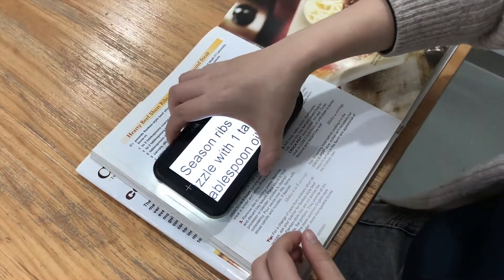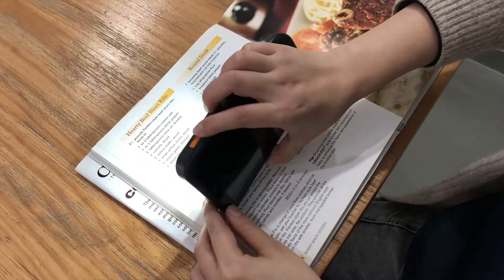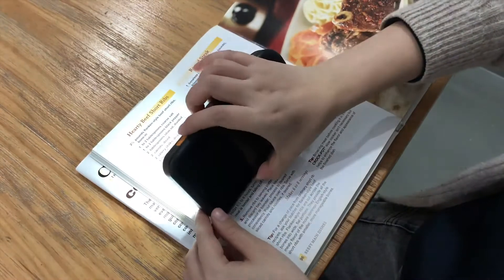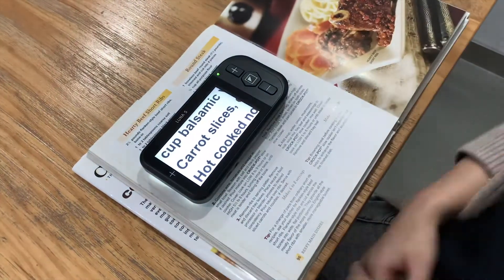Short press the power button to enter flashlight mode. While the camera light stays on, the screen will turn off. Short press the power button again to exit.